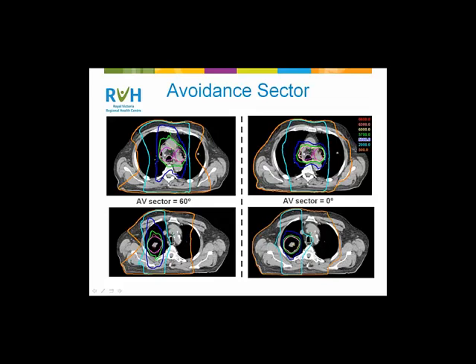Okay, against AAA with the heterogeneity correction turned on. What margin did you put on the fields? About a centimeter, standard, yes.